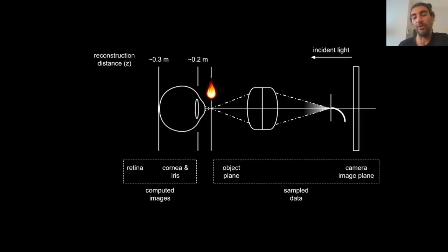And that used to be a limitation. The reason for this limitation is the optical safety limit that we cannot go beyond, because we needed to focus the light right in front of the eye of the patient. And this is kind of dangerous because the optical power can become very high in a very limited surface because of laser light.